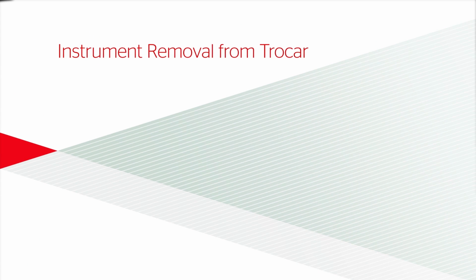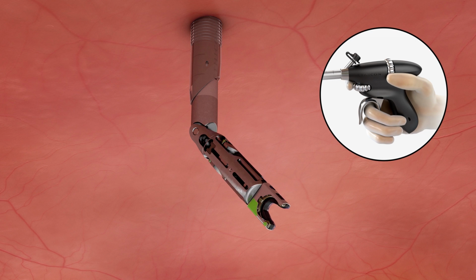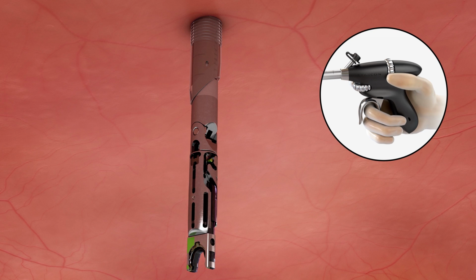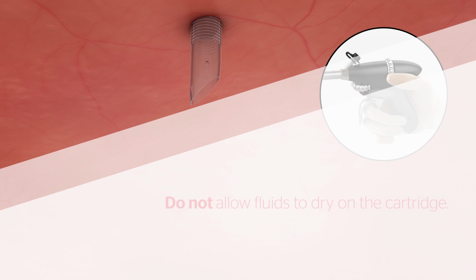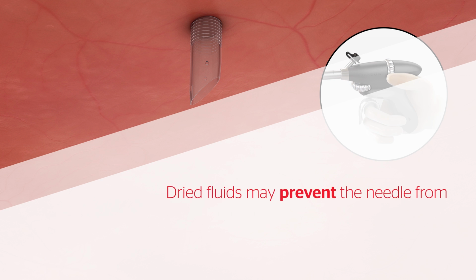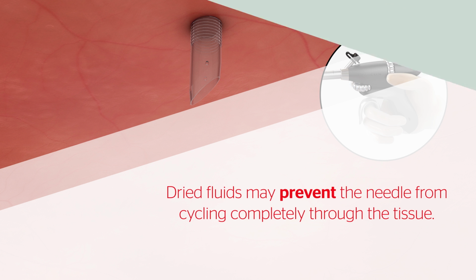Instrument removal from trocar. Articulate the distal tip of the instrument to ensure it is in the straight position and jaws are parallel, and then remove the instrument from the trocar. Do not allow fluids to dry on the cartridge. Dried fluids may prevent the needle from cycling completely through the tissue.